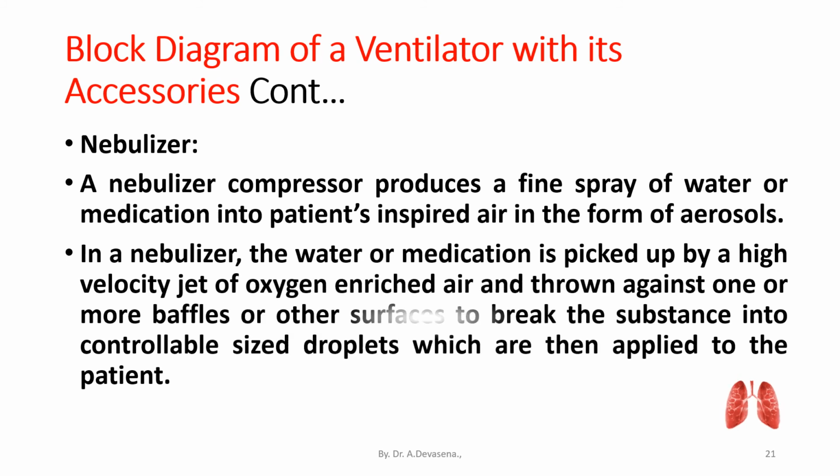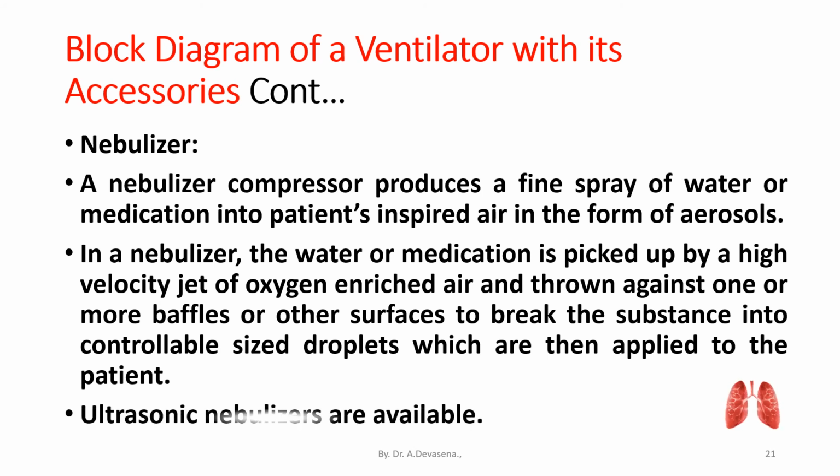In a nebulizer, the water or medication is picked up by a high velocity jet of oxygen enriched air and thrown against one or more baffles or other surfaces to break the substance into controllable sized droplets, which are then applied to the patient.